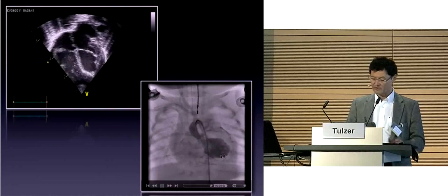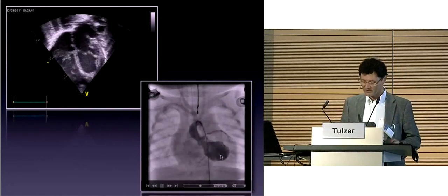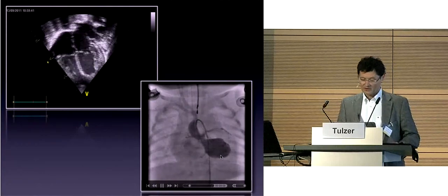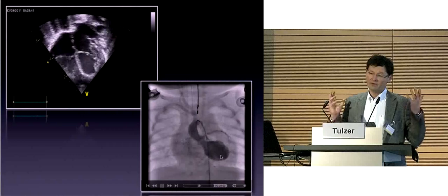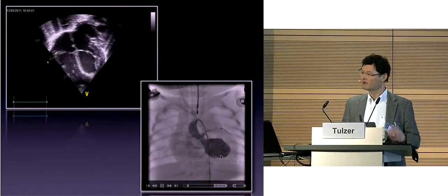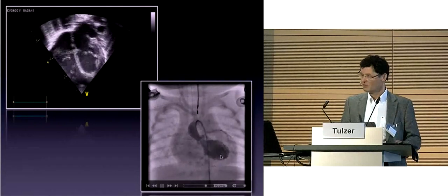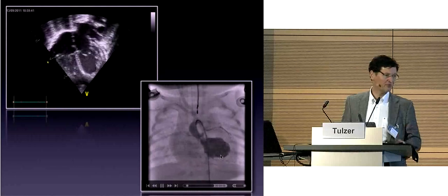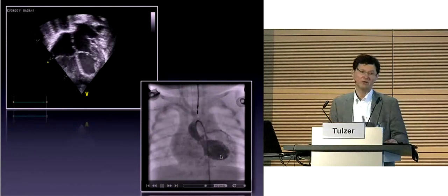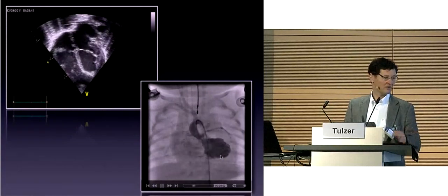During cardiac cath, you can see all kinds of cardiac dysfunction, and the question arises whether to dilate, go biventricular, univentricular, and so on. But basically, there are well-established criteria now for when to dilate an aortic valve in the postnatal period. Although there are no standards, as we heard, there are certain recommendations, and with a mean gradient of 40 or 50 millimeters of mercury, everybody would go to the cath lab and dilate this aortic valve.